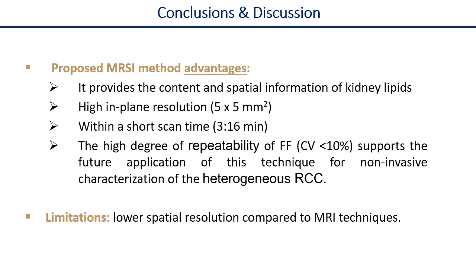In conclusion, we showed that the proposed MRSI method has several advantages. It provides the content and spatial information of kidney lipids with high in-plane spatial resolution, 5 by 5 mm squared, which is higher than most common MRSI techniques. Nevertheless, the data can be acquired within a short and clinically acceptable scan time.